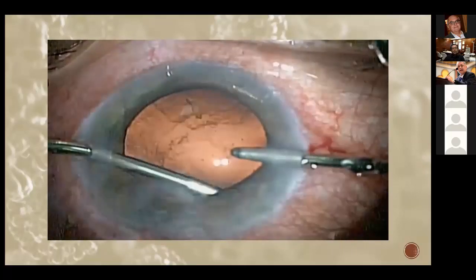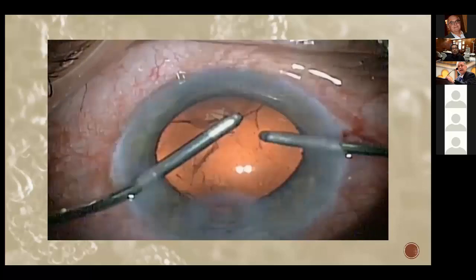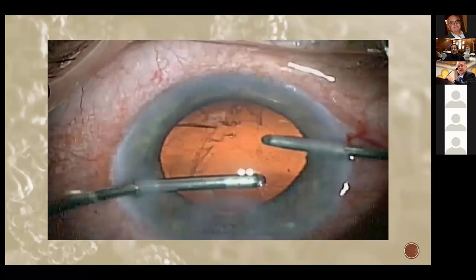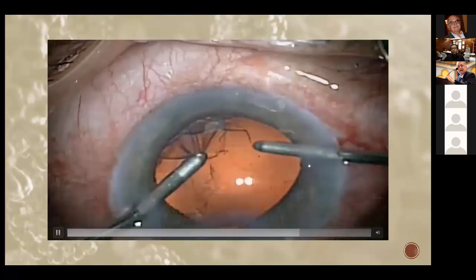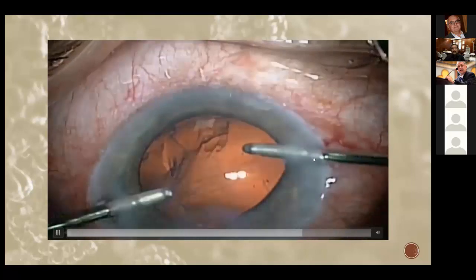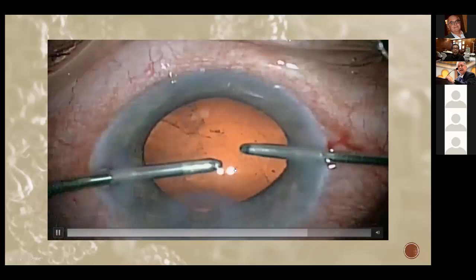And then you will see on the other side, I'm very happy with this now, and I'm really excited about it, and I'm hoping that the other sign is not going to be there. But you can see when I come to this side, the lens material is coming very easy, but on this side you can see that the lens material is captured in the capsular tension ring. And this is what you have to do, a side movement. It's more of a tangential movement to remove them. You don't pull to the center. You're going tangential to remove those lens material.